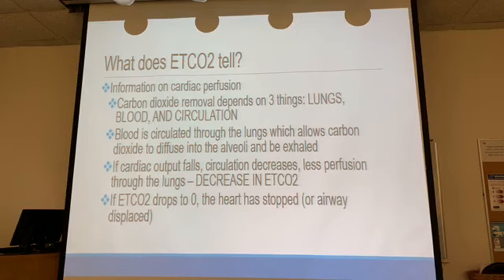That makes sense? If you see a decrease in circulation, you pick up a patient, they're hypotensive, what's going on? Their blood isn't pumping through their body very effectively, right? They're not getting very much blood flowing through their lungs like a normal person would. What are you gonna see? You're gonna see a drop in their end-tidal CO2, right? Why? Not because they're hyperventilating, but because they're not getting enough perfusion to their lungs. So you see how it can become a little bit tricky?